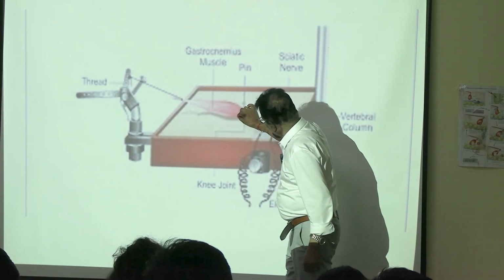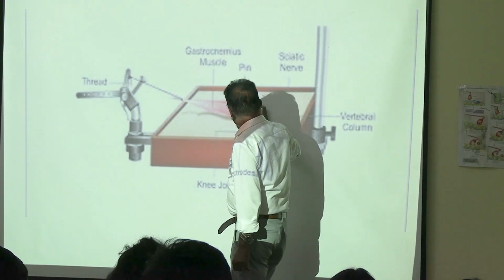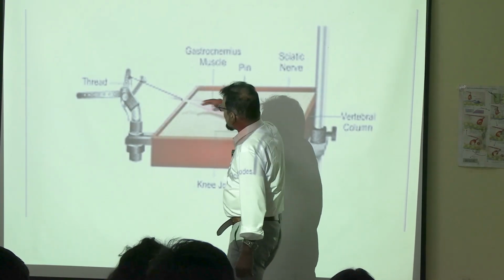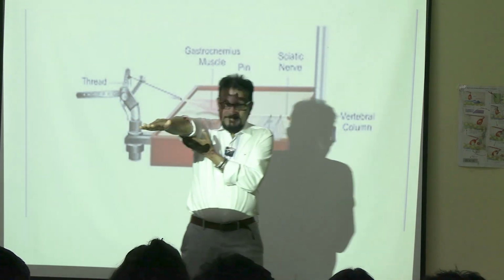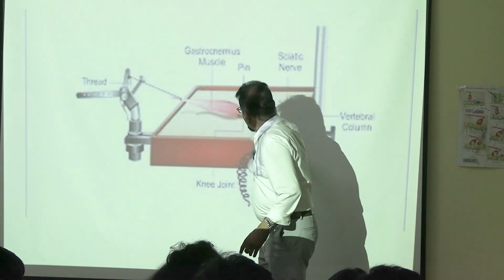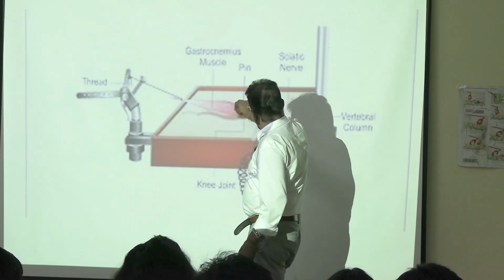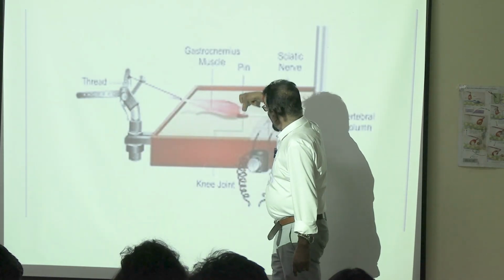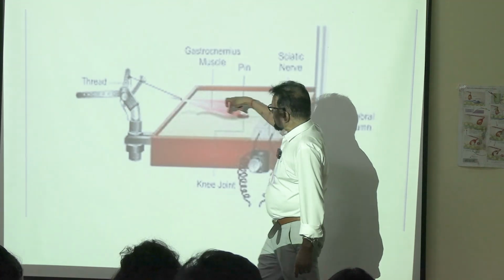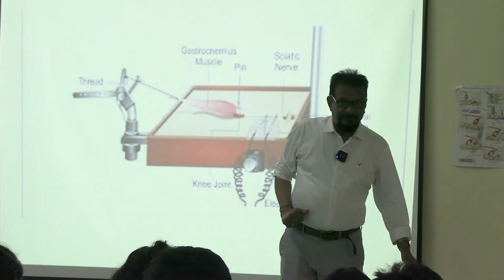Then you pull it this way, in such a manner, pull it so that this arm becomes horizontal. If it is loosened, it will come down. If you pull it this way, it will go up. So you fix it at a place where the long arm remains horizontal, at the center.